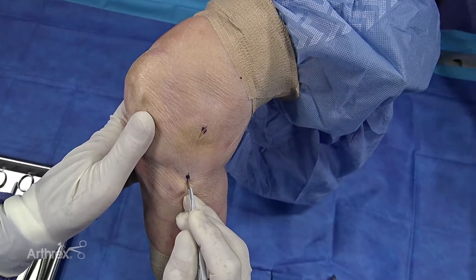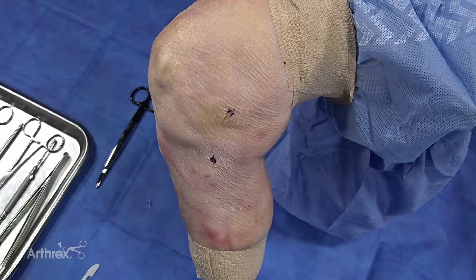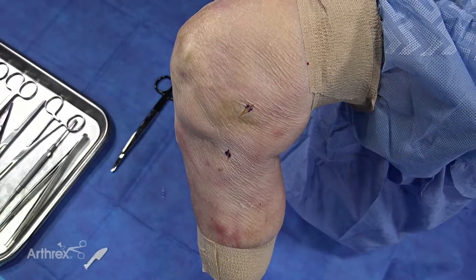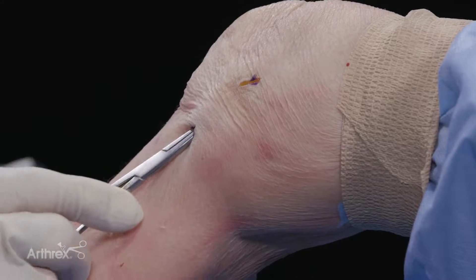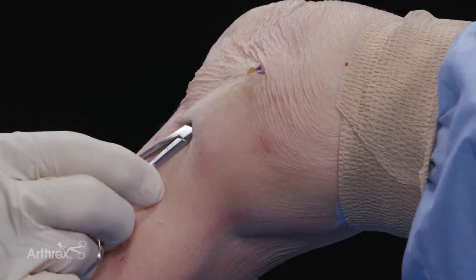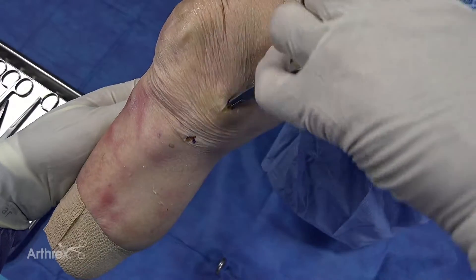I will then make a small incision distally. And then what you need to do is you need to undermine that area. We typically would use just a hemostat to undermine the area to get on top of the superficial medial collateral ligament, from top and from bottom.